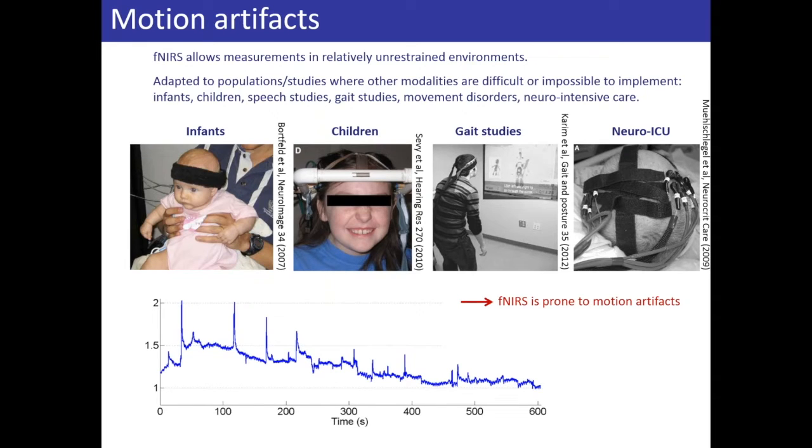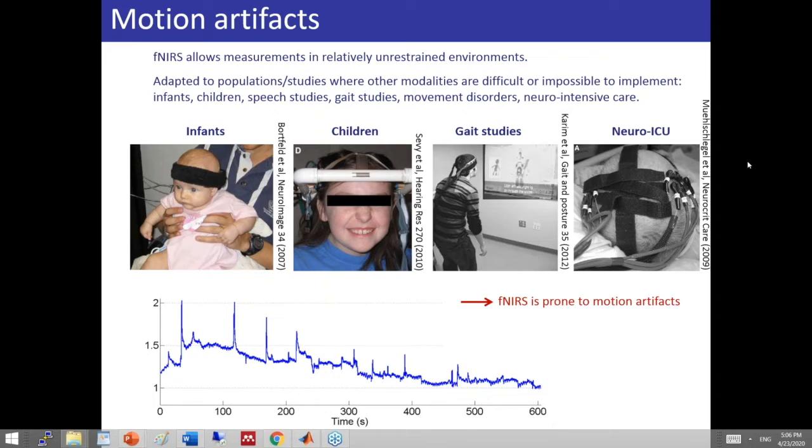Here is an example of how the motion artifact contaminated signal can look like. You can see there are some physiological oscillations. Do you see my mouse? Yes, okay. So we have spikes, as you can see here or here in the signal, and you can see some physiological oscillations here, much smaller than these large motion artifacts.